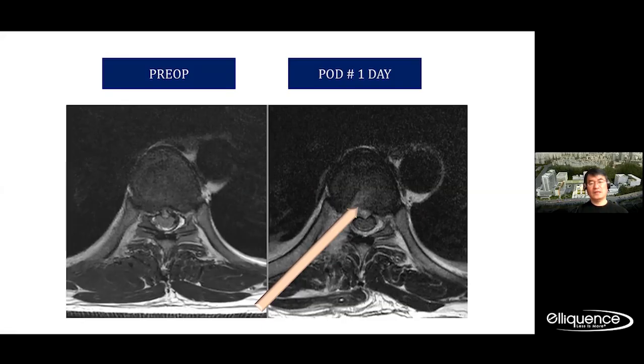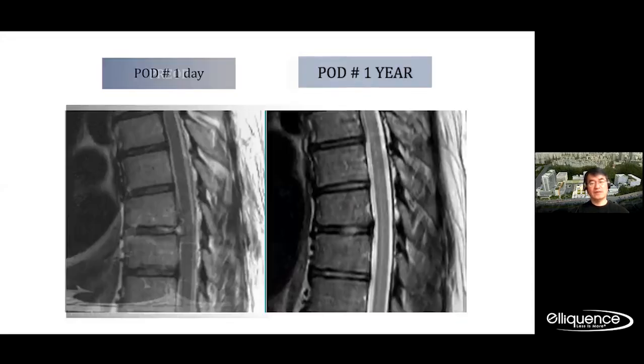This may enhance your safety because of the thoracic spine. The most important issue of the surgery is the safety issue, right? Of course, the thoracic cord, the central nervous system, is very vulnerable to any kind of additional injury from any kind of surgical instrument or surgical procedure itself.